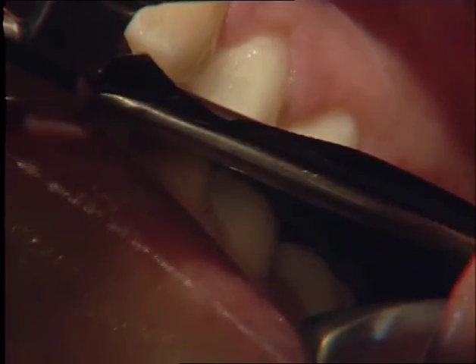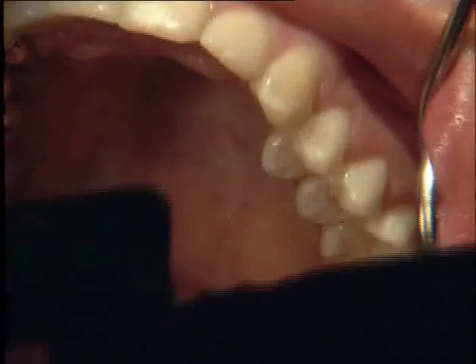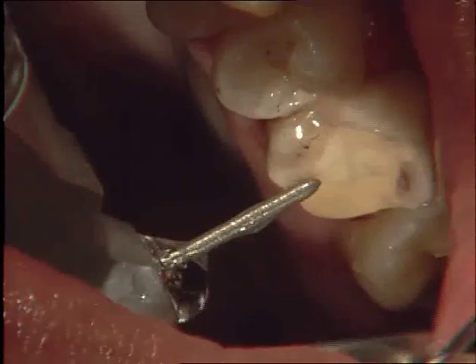This is done in a total etching technique followed by suitable dentin bonding agents. The tooth is checked for any interferences during centric occlusion and excursive movements.